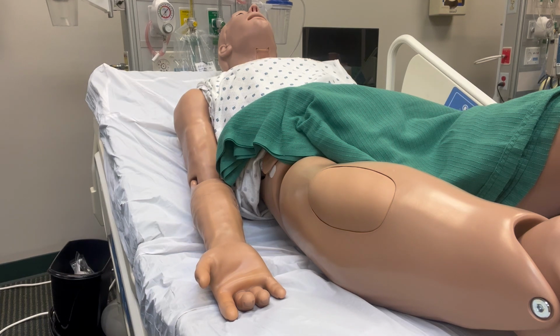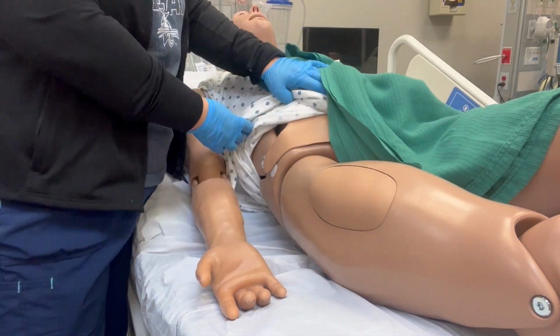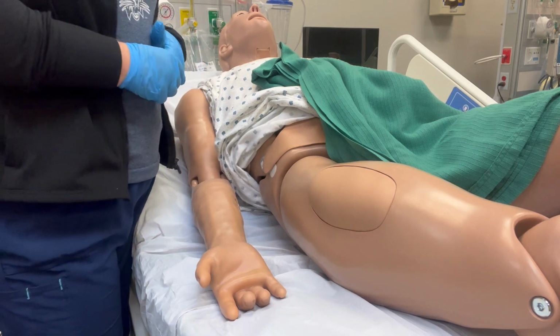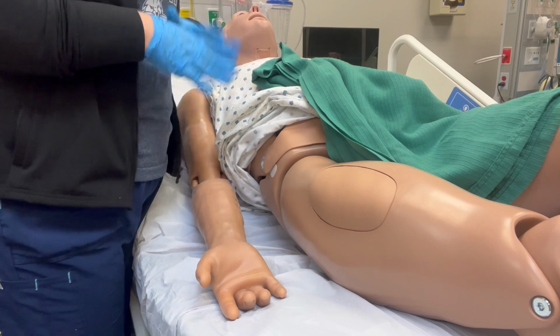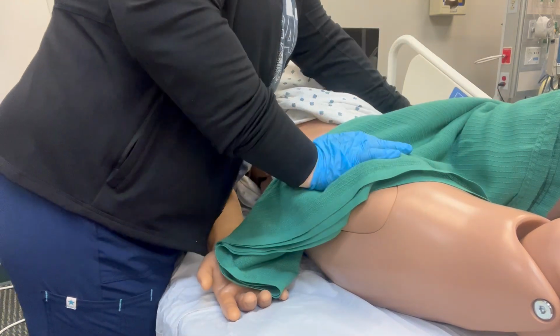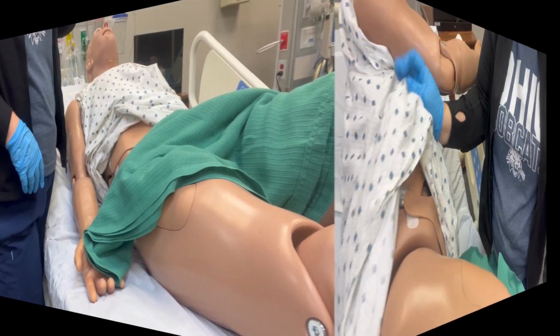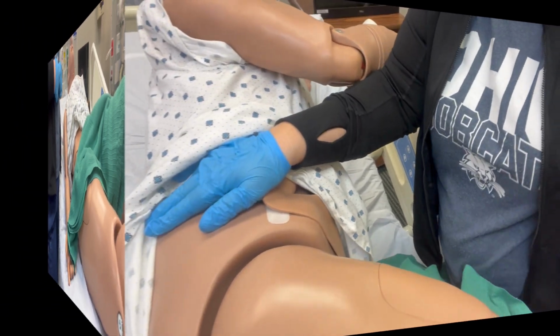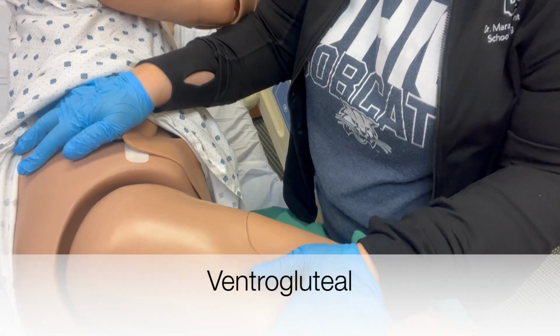And then finally, the other site that is most commonly used is the ventrogluteal. For the ventrogluteal, we do need our patient in more of a side-lying position, and we do need to be on the opposite side that we're injecting. So if I was on this side, then I would want to inject in this hip. Okay, so if I was on that side, I could inject on this hip. For this, you need your patient in a semi side-lying position, if at all possible.